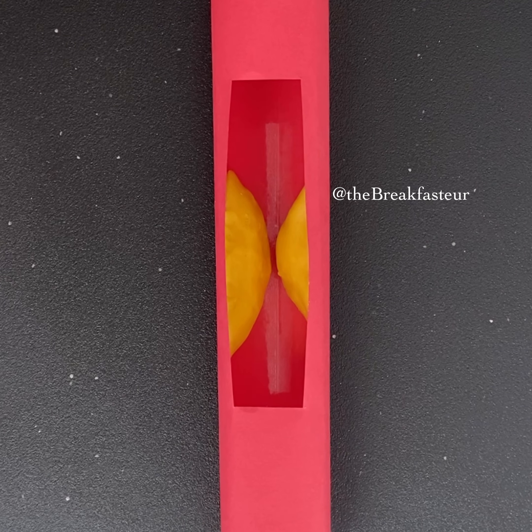So we pushed the wire and a catheter — a thin tube — up to the heart. We took pictures, and this is what our coronary artery looks like.